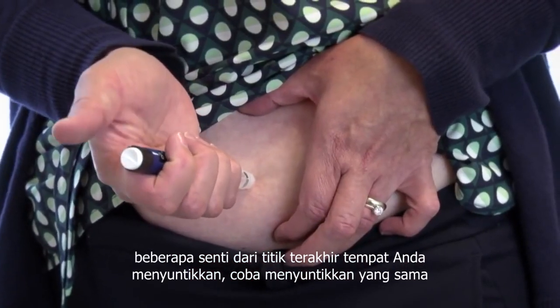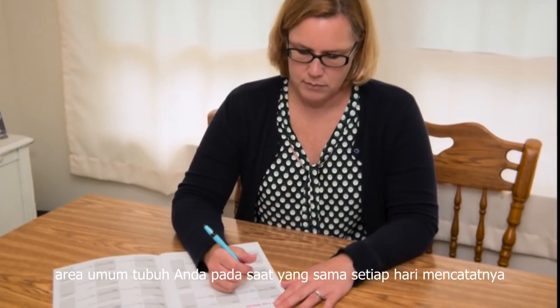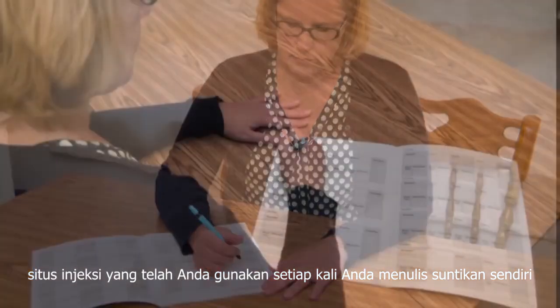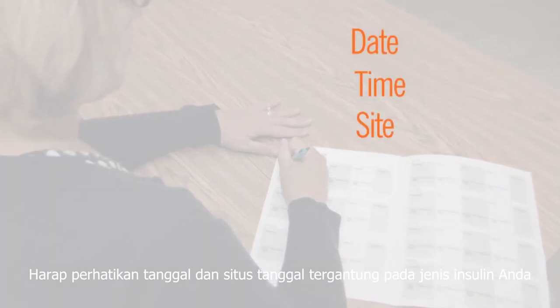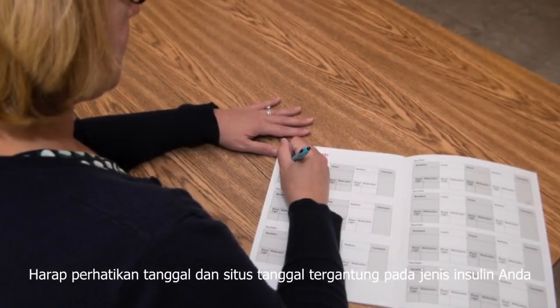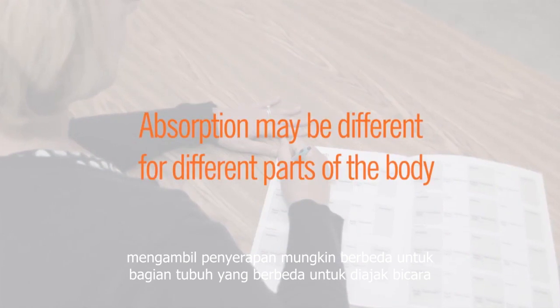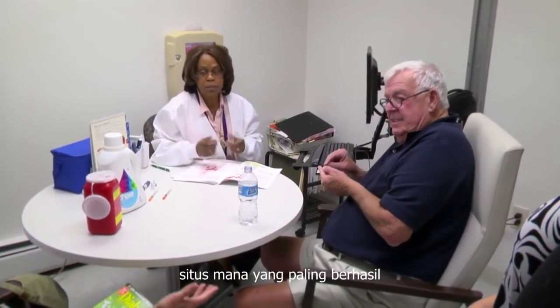Try to inject in the same general area of your body at the same time each day. Keep a record of which injection sites you have used. Every time you give yourself an injection, write down the date, time, and site. Please note, depending on which type of insulin you are taking, absorption may be different for different parts of the body. Talk to your healthcare provider to learn more about the insulin you are using and which sites work best.